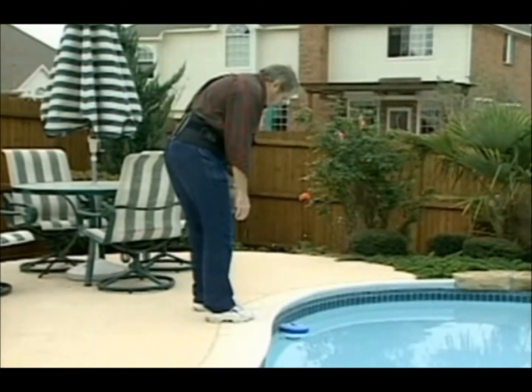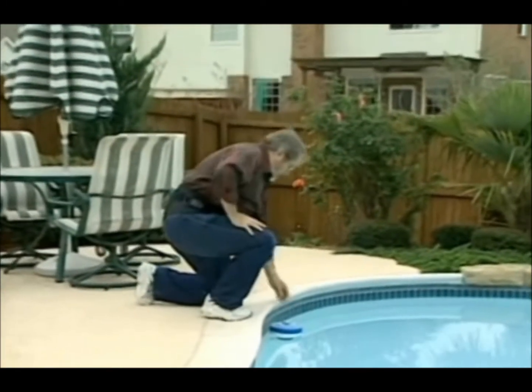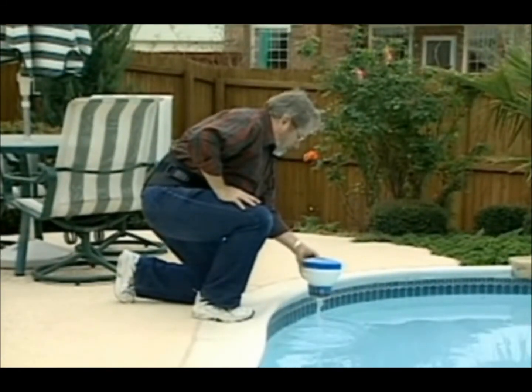Trying to bend over like this is almost impossible while wearing your brace. Obviously, this position is a lot better for your back. Be sure you use the diagonal foot position for balance.